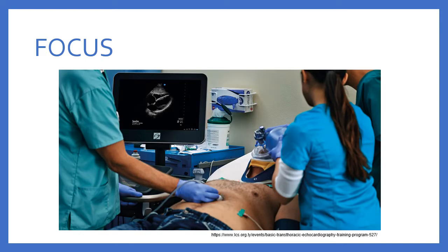On the other hand, focused cardiac ultrasound is very different. It uses a very basic machine with very little controls. Typically, we only obtain 5 different images and use only 1 or maybe 2 different types of ultrasound modes. Oftentimes the environment is chaotic and there's a lot of other things going on that can distract you from trying to get the images and interpret the images at the bedside. And also the clinicians using focused cardiac ultrasound have limited training as opposed to a long cardiology fellowship or a long technology school for obtaining images at the bedside.